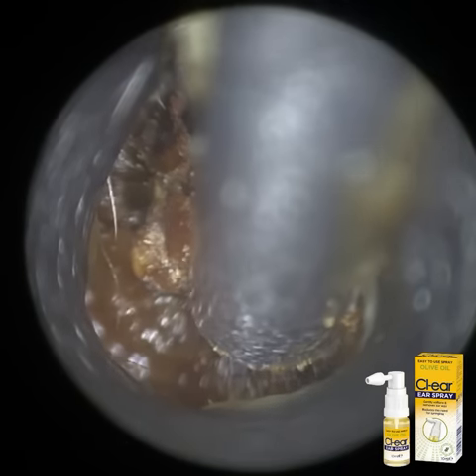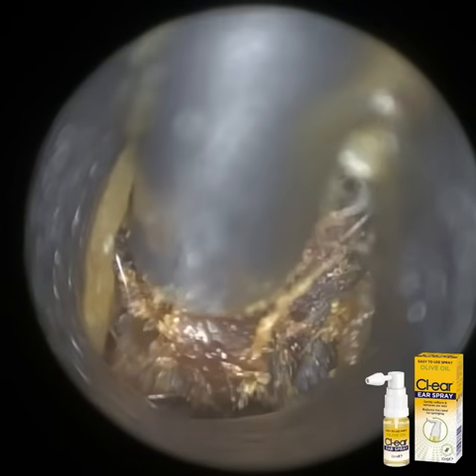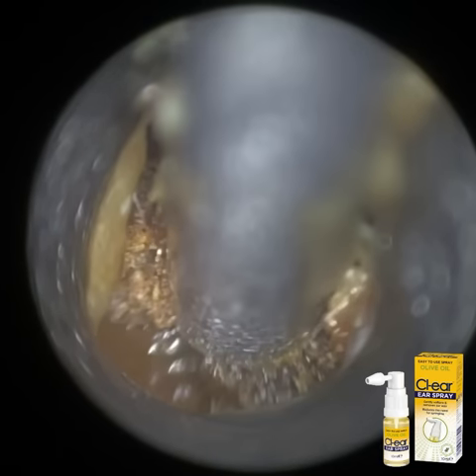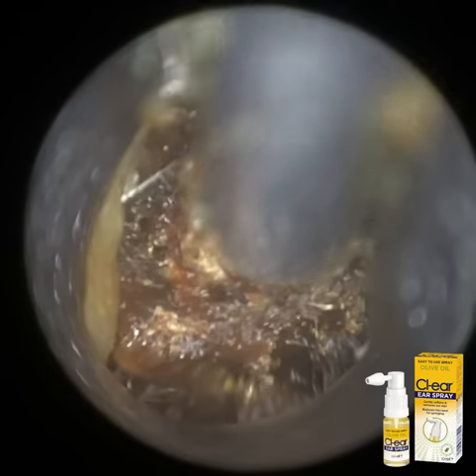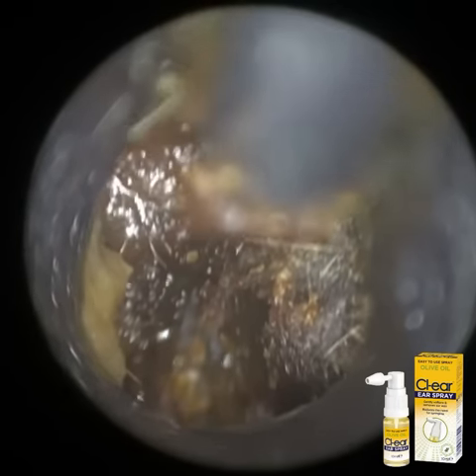The original view that you saw was taken with the iClearScope endoscope, and you may have spotted that the ear canal, as you enter, the first bend was quite narrow, and then the ear canal protruded outwards, which can make removing the earwax a bit more challenging, because the plug of wax is actually larger than the entrance and the more lateral aspect of the ear canal.